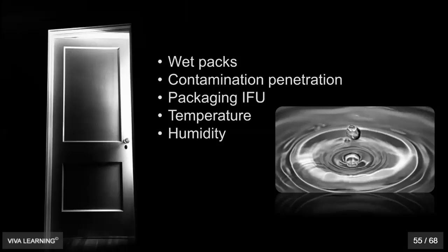And so what causes wet packs? Basically, one of the first things is poor steam quality. If you've not loaded your chamber correctly and there's air that's trapped in there, if you didn't use the correct cycle time and drying times, if you didn't place the configuration, how you put the pouches and packs into the sterilizer, or you weren't mindful of the mass, the weight load that's set by each instrument or sterilizer manufacturer. So in most cases, if you take out 7 packs and only one of them is wet, usually that's due to some type of user error. And again, overloading is the number one thing that we look at.